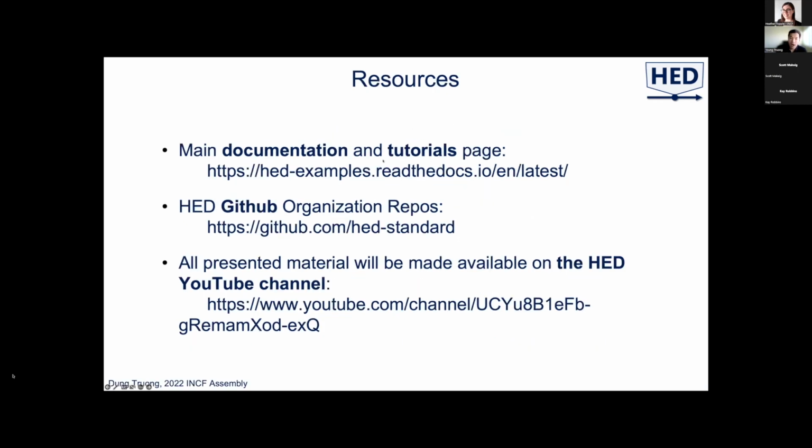You can check out our online documentation and tutorials on the hed-examples.readthedocs.io webpage, and all the tools you can download from our GitHub organization repos. In the future, we'll be making tutorials on YouTube so that we walk you through step by step each part of the annotation as well as the HED analysis process.